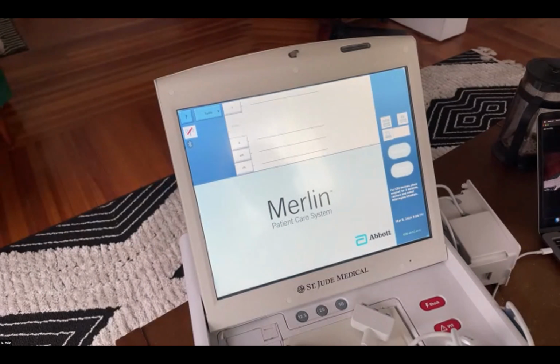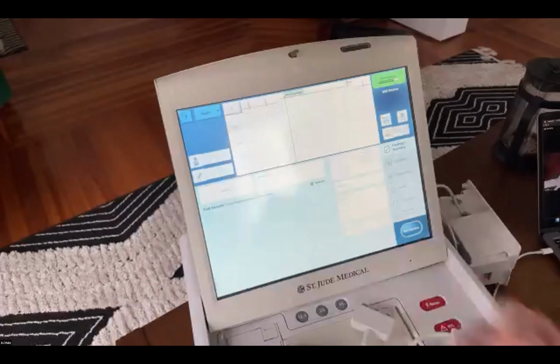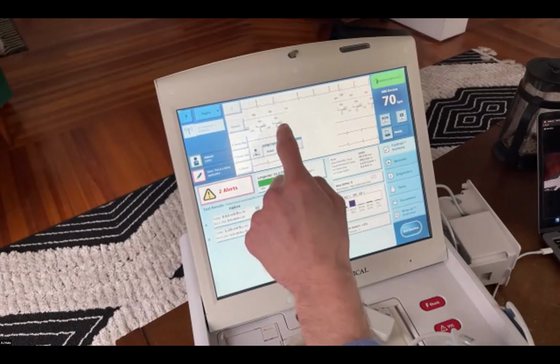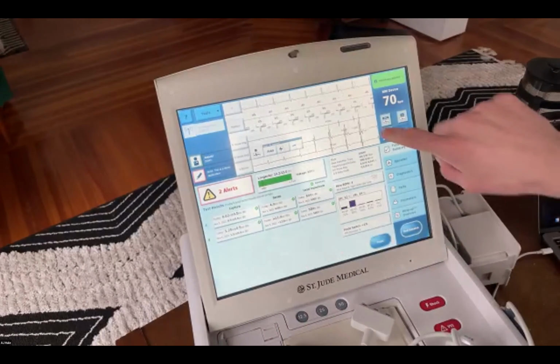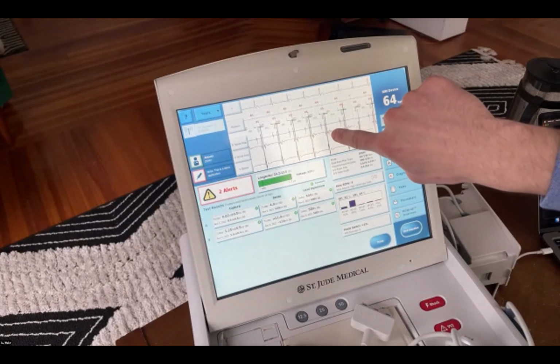It's the bipole that the device sees itself. So if you look at the actual signal itself, this may not be a great example because it's a demo. But if you look at an A sense amp signal, it's very narrow and spiky. Let me see if I can gain this up. This is a bad example here. I don't think it's going to be great. Okay, if you see here, it's just very spiky amplitude. It's very hard for the human eye to discriminate this right here.